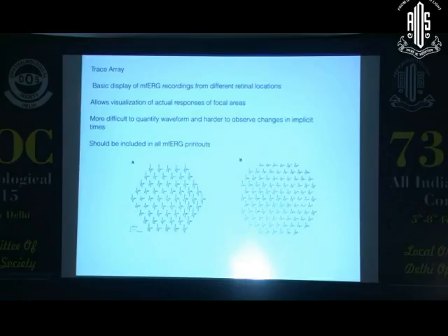Somehow it is a little more difficult to see any variations in the waveform because there are so many, but the machine does a lot of things for you. It calculates the amplitude, it calculates the implicit times, and tells you a lot about these waveforms.